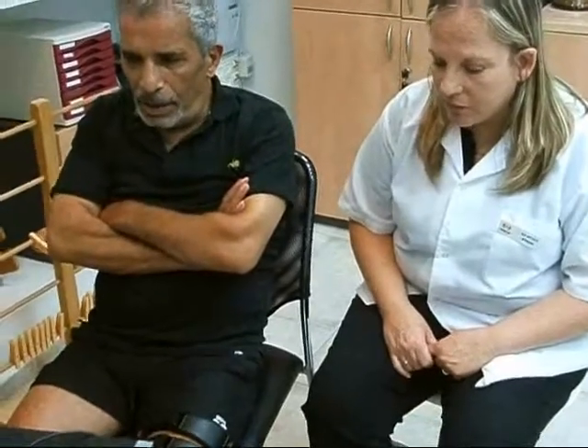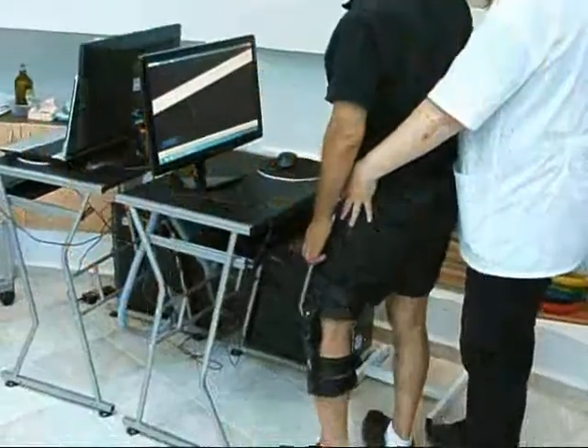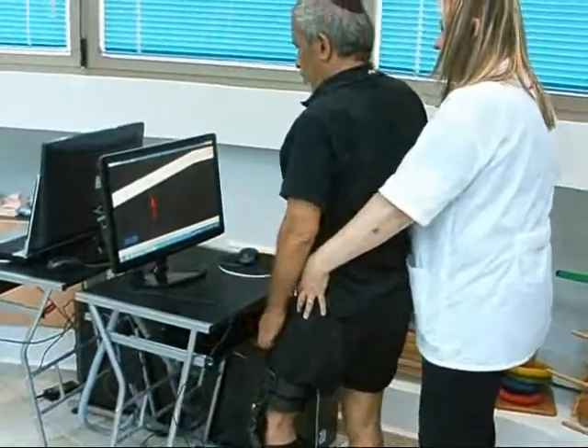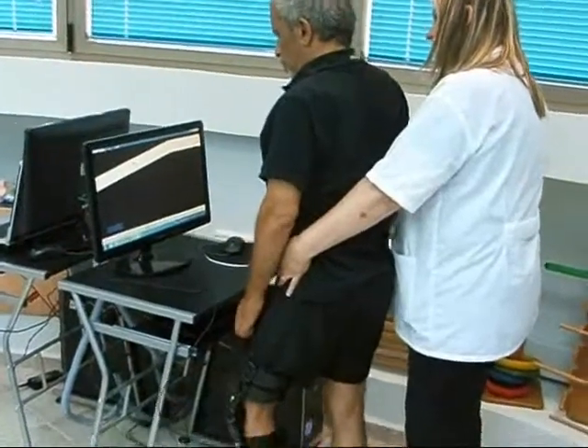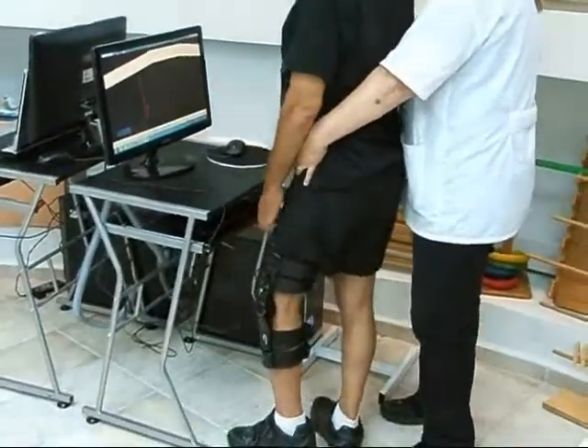Exercising with the Leg Tutor can be either open chain or closed chain, as the Leg Tutor can be used in the lying, sitting, or standing position. The patient can also perform the exercises as assisted active, active, or against gravity and resistance exercise practice.